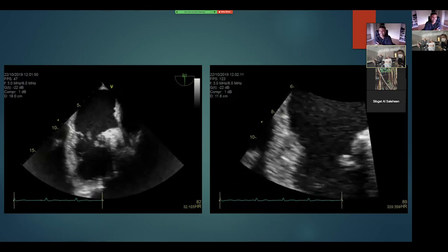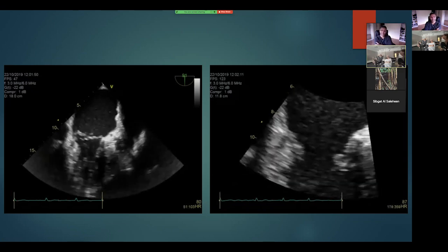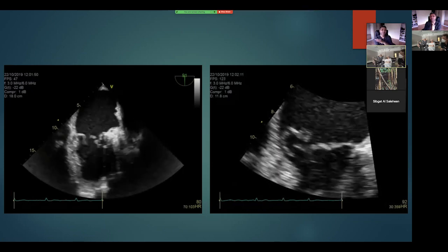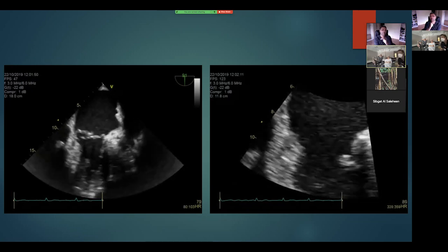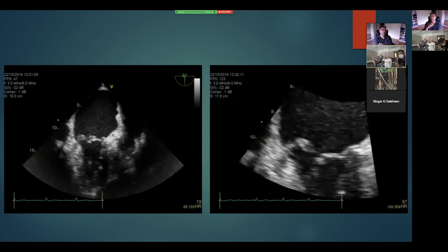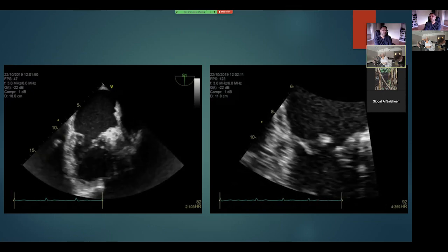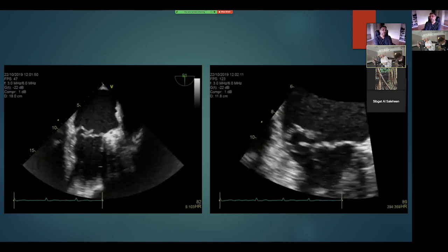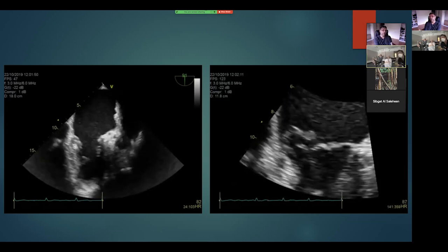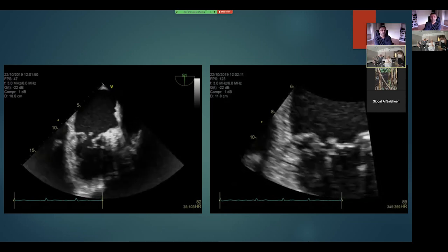In the 2-chamber, from the right, it'll be P1, A2, P3. So that looks like a 60-degree commissural view. In the 2-chamber 90-degree, if you remember, this is the only view where we can see all the scallops of anterior, A1, A2, A3, and a little bit of posterior, which is P3. So P3, A1, A2, A3, that's our standard view we see at 90-degree 2-chamber.